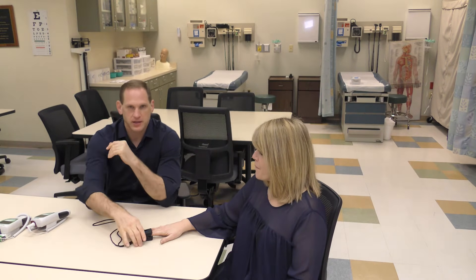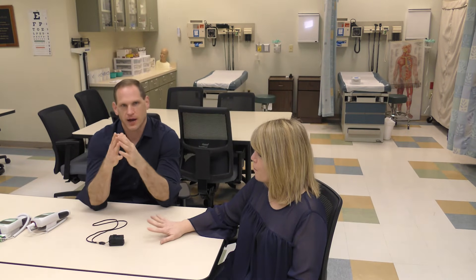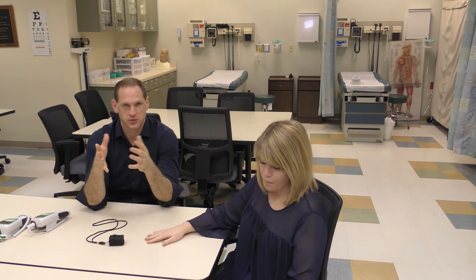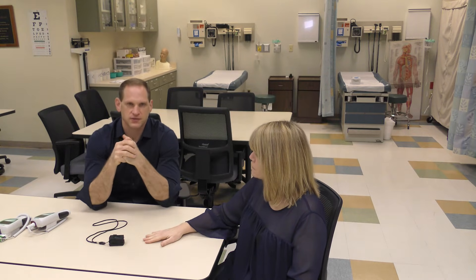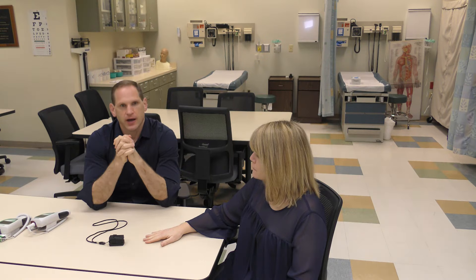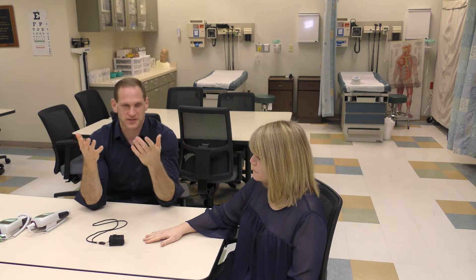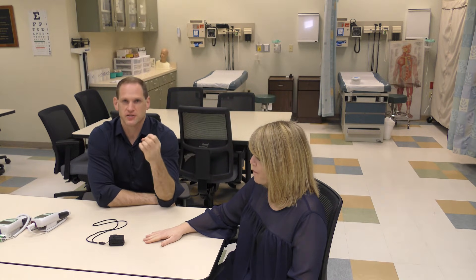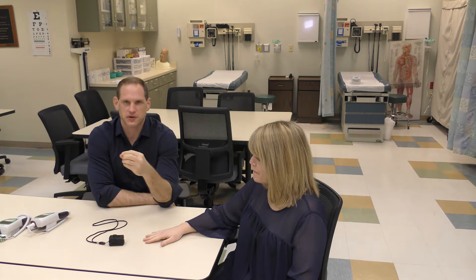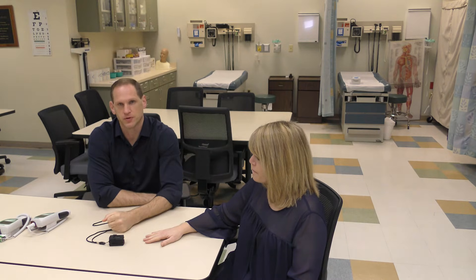Other things that can impair the reading include thick nails or acrylic nails. If a patient has acrylic nails you can remove them if needed, or defer the test if it's not urgent — sometimes pulse oximetry is done routinely rather than when it actually needs to be done. Also consider fingernail polish: if the patient has nail polish on, you can still try; most of the time it'll work. If it doesn't, use a different finger or nail polish remover.